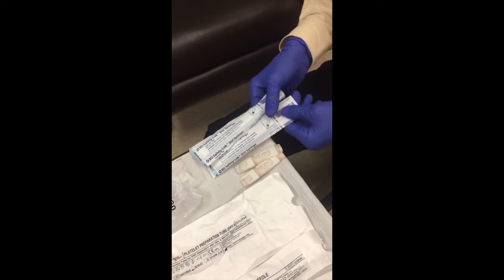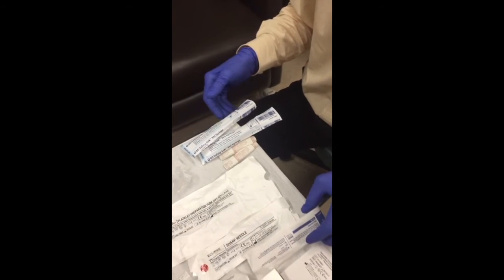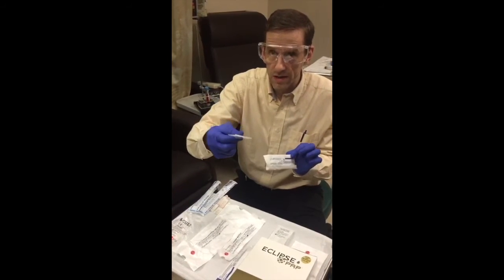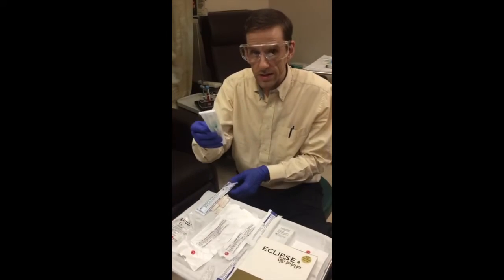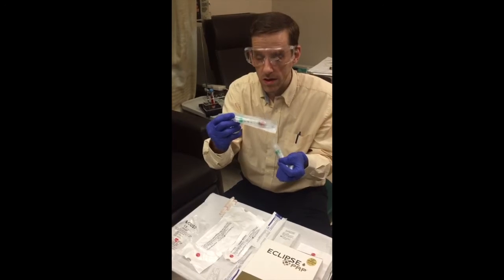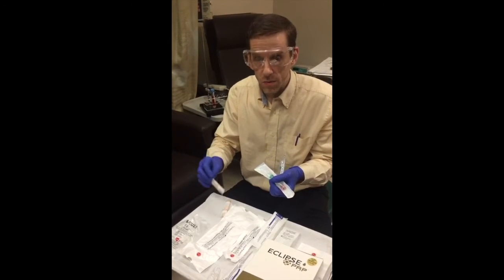What they typically do is suck out the platelet-rich plasma with a 10cc syringe — putting six cc's in and injecting with a 27 gauge needle into the scalp. Instead, what I'm going to do is suck out three cc's and three cc's so I have more control. That's the approach we use at this institution, and we'll use a 30 gauge needle because it's nicer for the patient.